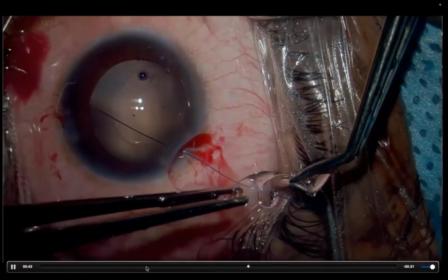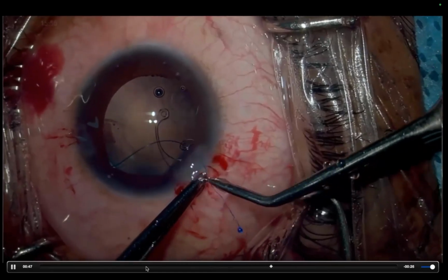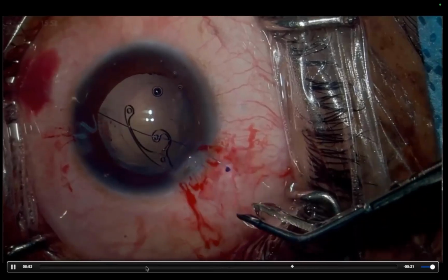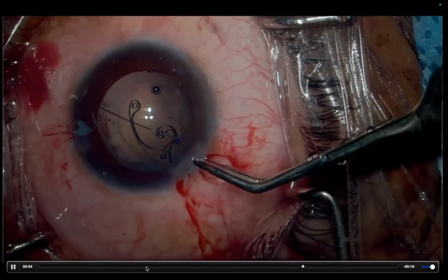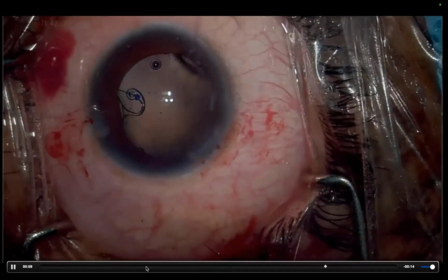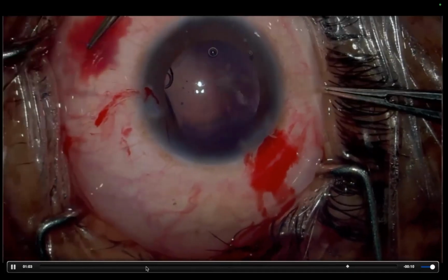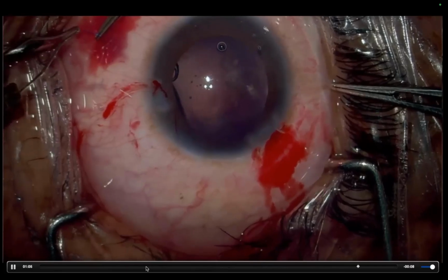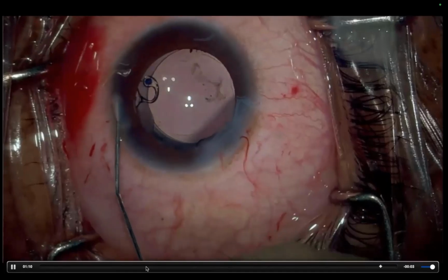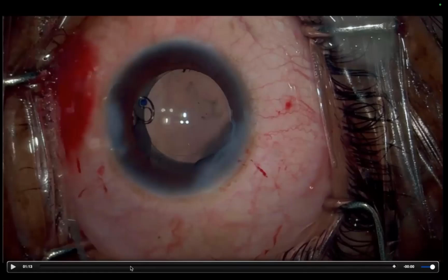The flange, so initially what I did was try to put the flange underneath because I thought that would be stable, and that applies for IOLs and CTS. But there is a challenge where the flange sometimes has to sit between the capsule, and it shouldn't pull the capsule along. So now I've shifted to keeping the flange on top and bringing the suture from underneath. So the rule of doing the capsular tension segment is that you don't stretch the bag too much.